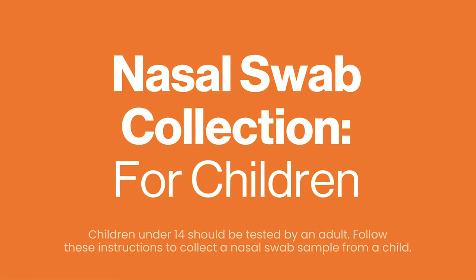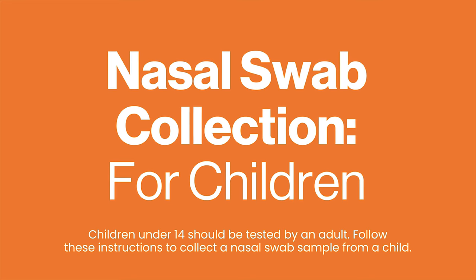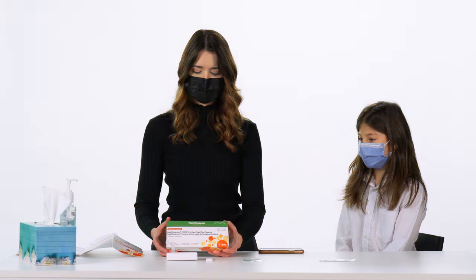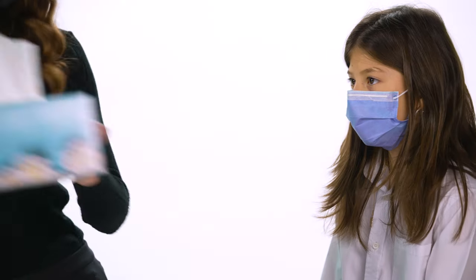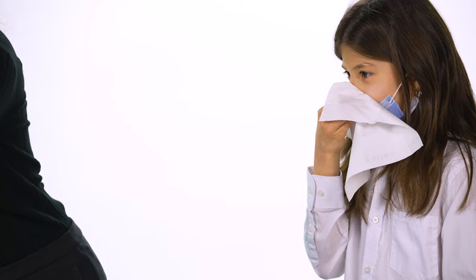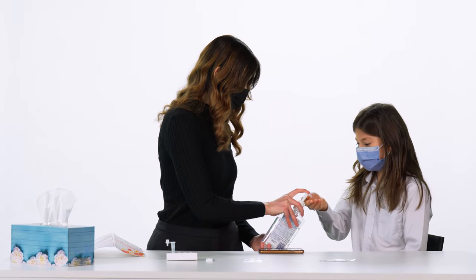Nasal swab collection for children. Children under 14 should be tested by an adult. Follow these instructions to collect a nasal swab sample from a child. Show the child the test kit and explain what you are going to do. Have the child blow their nose and throw out the tissue.